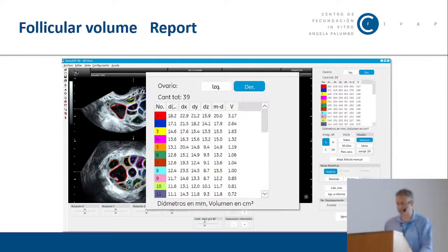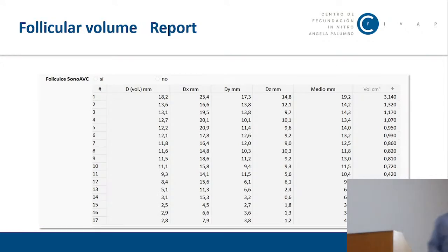This is a report we obtained with SonoAVC. This is the volume of the different follicles.